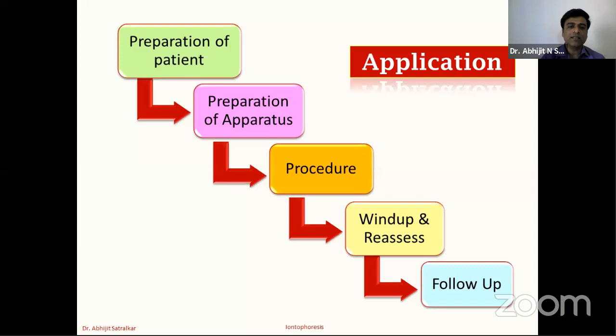What we do next is reassess the patient. Now, this is very important because sometimes the patient might react to some ions, sometimes on the skin. So this is very necessary while we complete our treatment. And after this, follow-up takes place, and we are going to check the same preparation part and again the preparation of apparatus in the follow-up sessions.